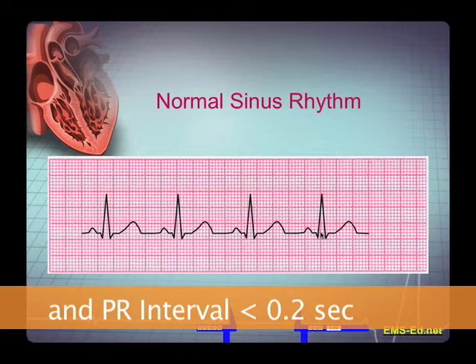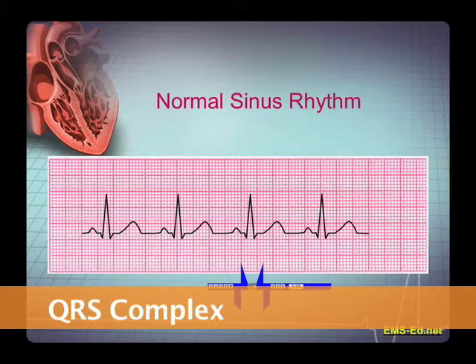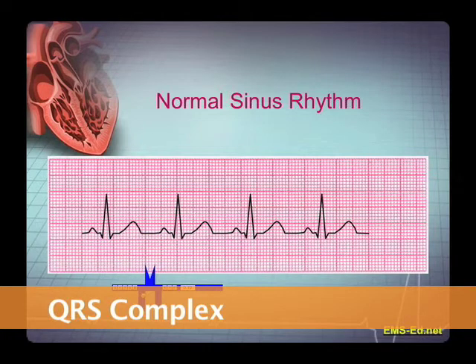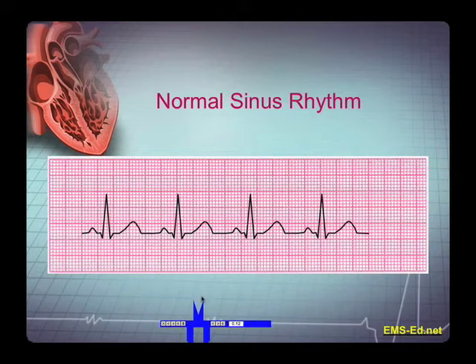Now let's look at the QRS complex. In order to be within normal parameters, the QRS complex needs to be less than three little boxes. So let's take our calipers and set them at three little boxes, or 0.12 seconds, and ask ourselves: is the QRS complex less than that? It appears to be so — we have a normal QRS complex. Were this a 12-lead EKG, we might look for evidence of a pathological Q wave or ST segment changes, which we cover in another video. So what do we have here? We have a normal sinus rhythm — the rate is between 60 and 100, and there are no blocks or ectopy.